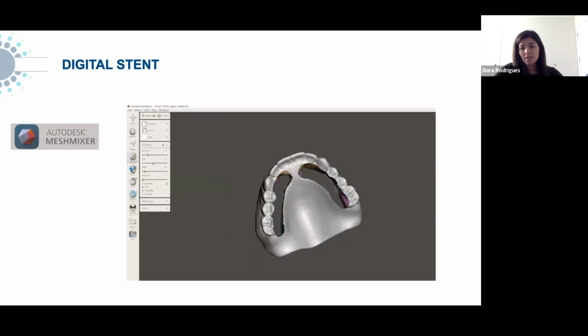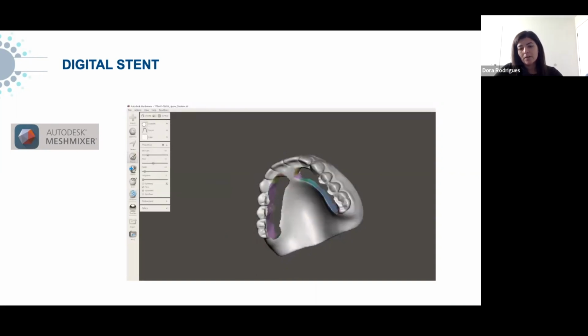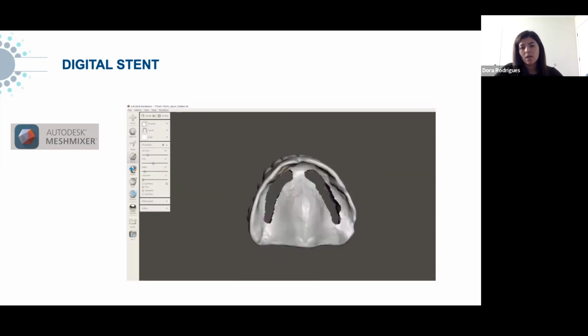And then you can just send it to the printer and you don't have to grind all the acrylic in that area once you print the denture. So it's really easy to do. And again, it's free, and it's really good software to do these little things.